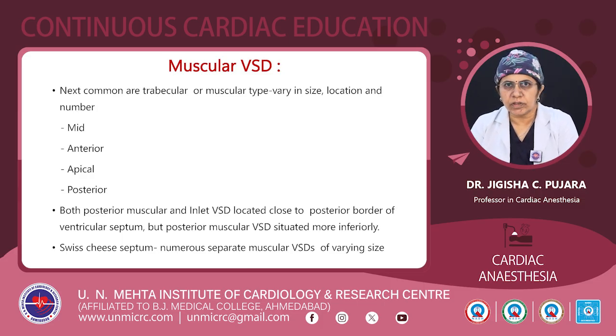Another entity is the Swiss cheese septum. When there are numerous separate muscular VSDs of varying size on the muscular septum, it appears like Swiss cheese, so it is called a Swiss cheese septum.